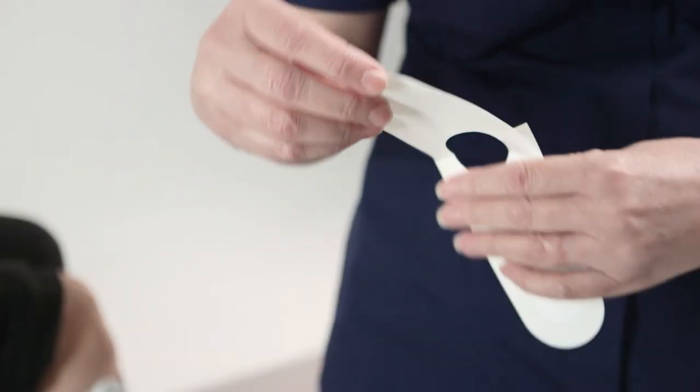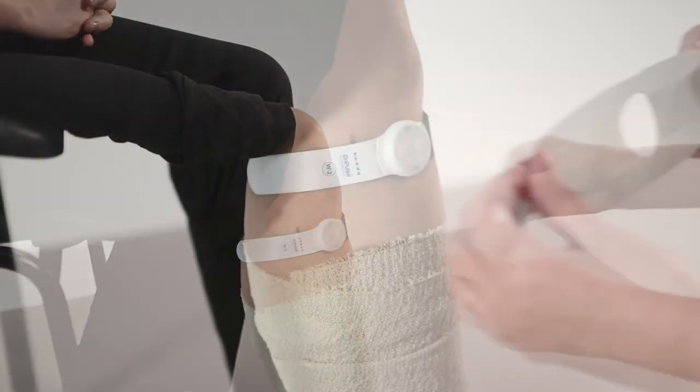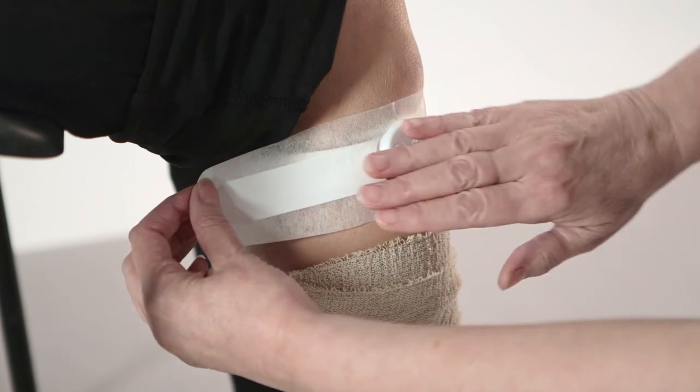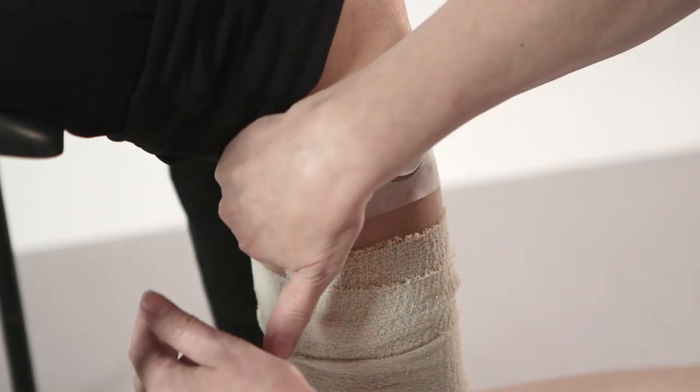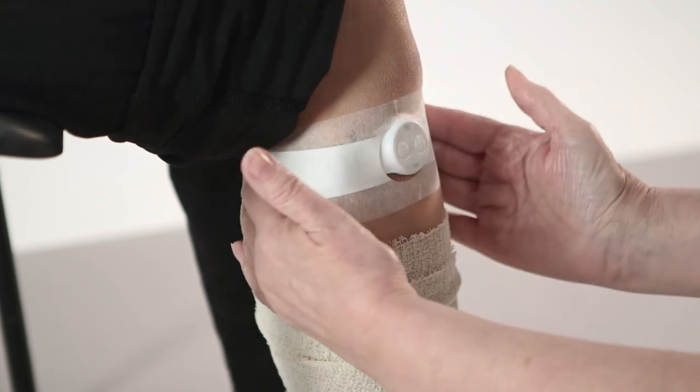For additional security of position, use the hypoallergenic adhesive strips that can be fastened over the device. This will adhere best to clean, dry skin when gentle but firm finger or hand pressure is applied to the adhesive strip from the center outwards. Never apply under tension as this may induce blistering or skin tearing.